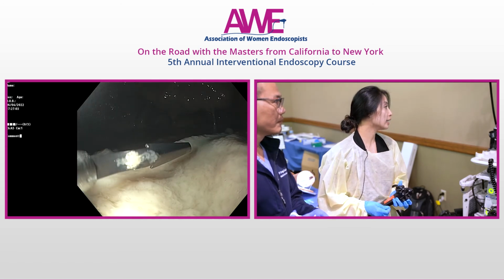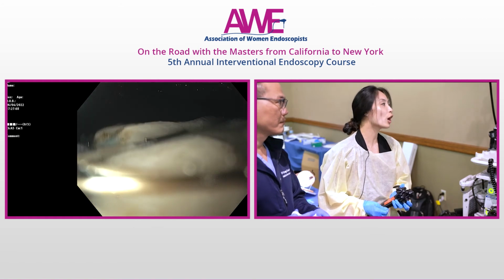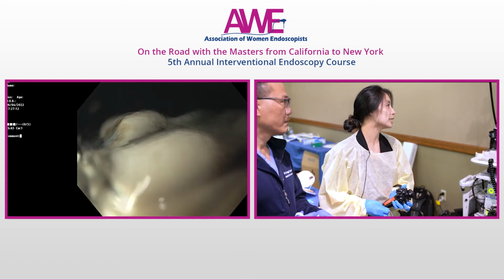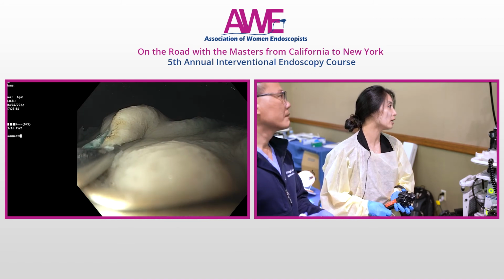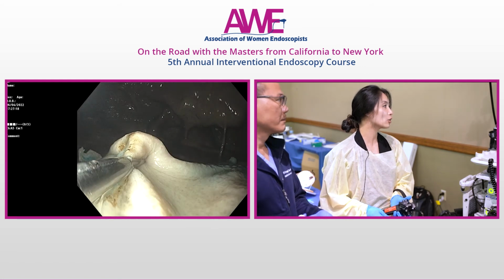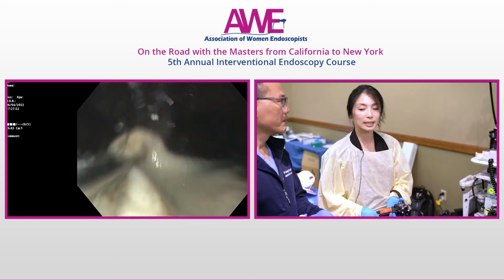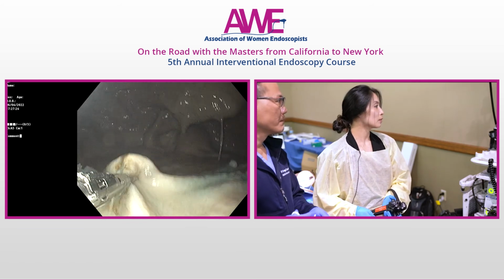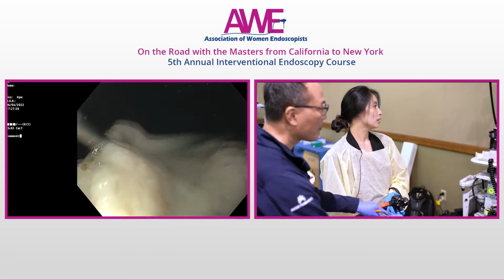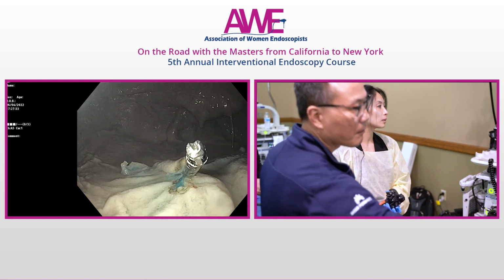So I think here it's a relatively linear defect, and you can probably close it with one clip. But if we were going to do multiple, we would do distal to proximal, so angling down, making sure we have both sides. And you can actually look at it and you can wash it and look before you deploy. So it looks like we've got both sides, so we can deploy there. And then your assistant will open it. Okay, so we could do maybe one more clip.